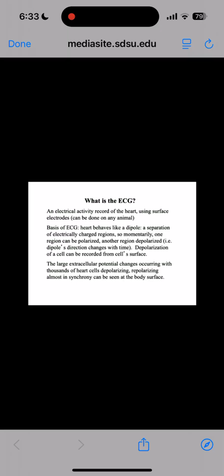One of the things that I'll say is that depolarization and repolarization events are both part of the dipole. But what we are actually recording in an ECG is the dipole of the heart. Now, the reason that we can do this is because our heart has 2 syncytia, and they are almost synchronous when they depolarize and repolarize, that produces a large electrical wave or current that can be seen above most of the other activity in the body, okay?